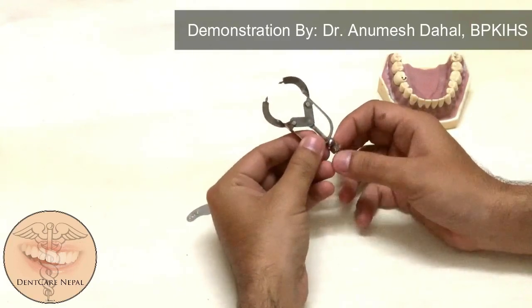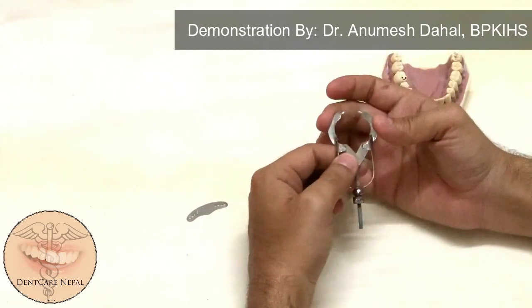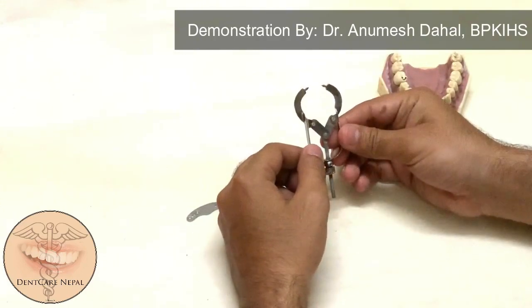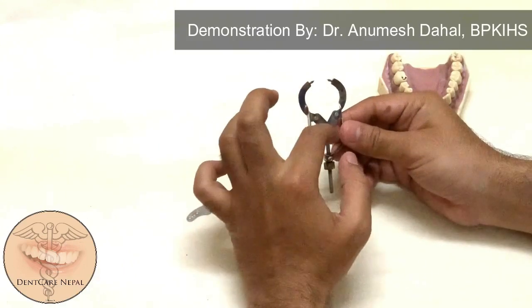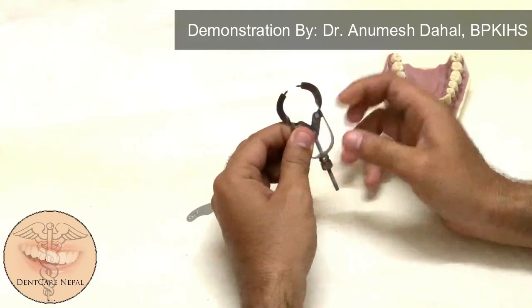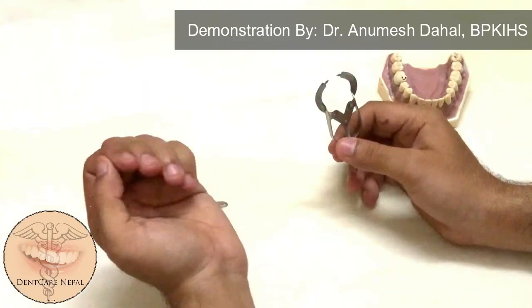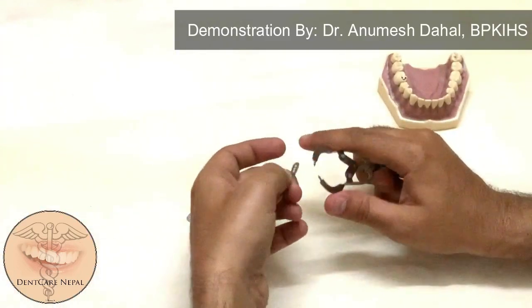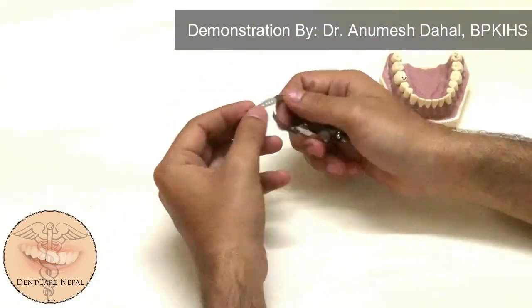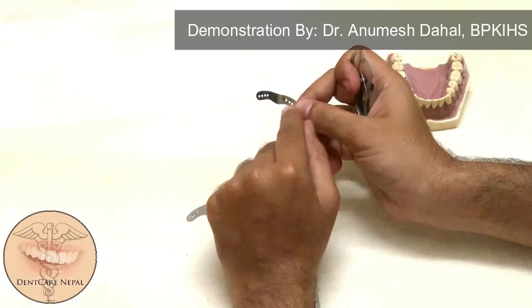How does this work? If we turn this knob, the pincers — the pincers of this retainer — work like the pincers of a crab. As we turn the screw, the hands of the crab close together and they tighten the band. The band has holes of different sizes at different distances from the midline.